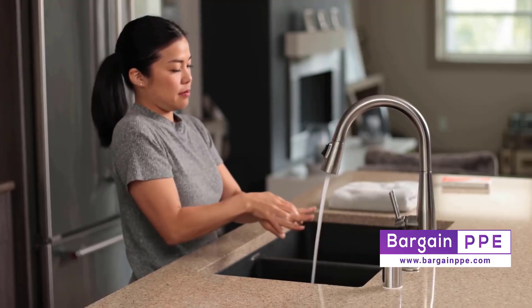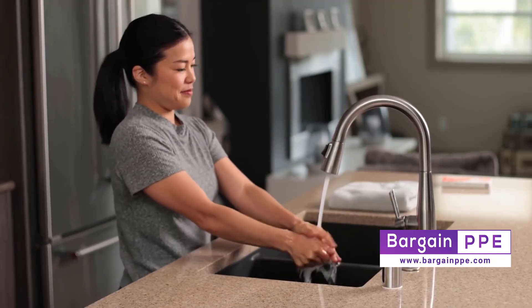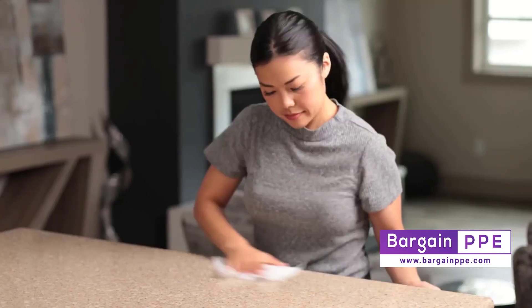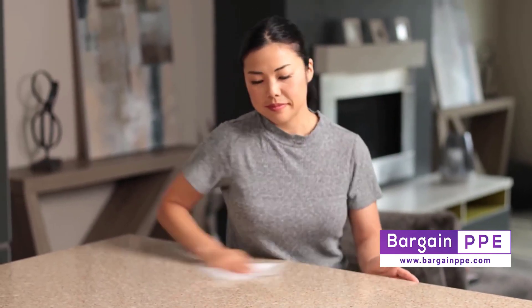For starters, thoroughly wash your hands with soap and water. A good scrub down and some disinfectant is perfect. We also need a clean, flat testing area, so take a moment to disinfect some counter or tabletop space.